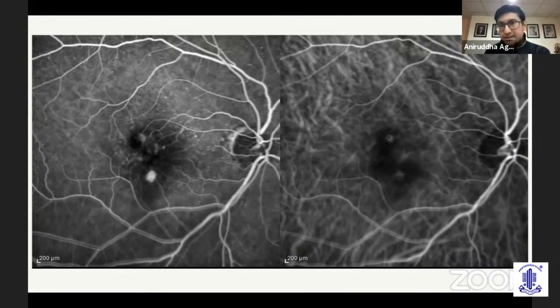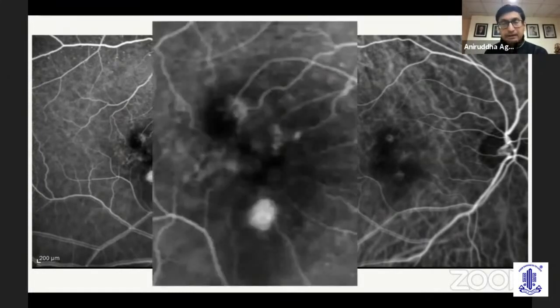So on the fluorescein angiography, on your left side, you can see in the superior aspect a hyperfluorescence in the macular area and a more hyperfluorescent area inferiorly. A similar appearance is seen on the ICG imaging, and a blown up figure here shows you two vessels which are coming together superiorly in the hyperfluorescent area, and the lesion down below is hyperfluorescent, but it has sort of a heterogeneous nature. It has certain foci which are more hyperfluorescent within the lesion itself.